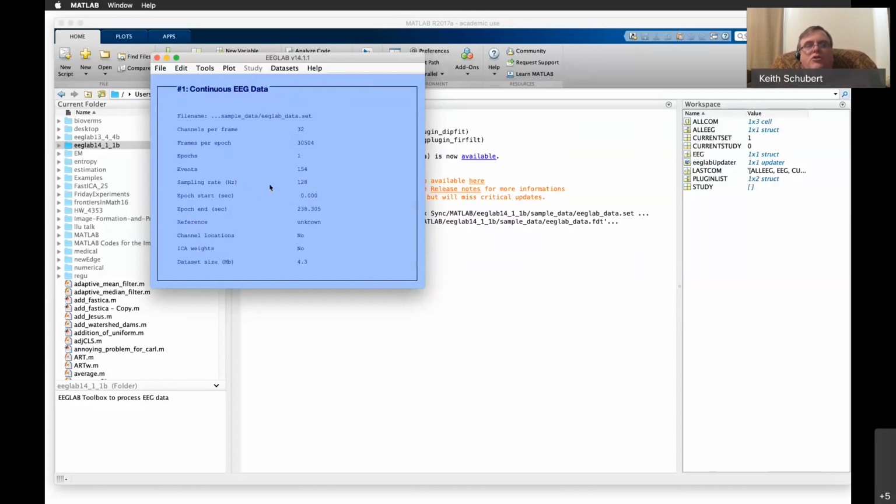When you're measuring, you usually measure higher. But in this one, they had a higher sampled one and they downsampled it. Downsampling is commonly done to make it a decent amount of processing. And you can see even with 128 in a second, they've got, was it 4 minutes worth of data basically. So you can see there's an awful lot of frames they're dealing with in each channel.